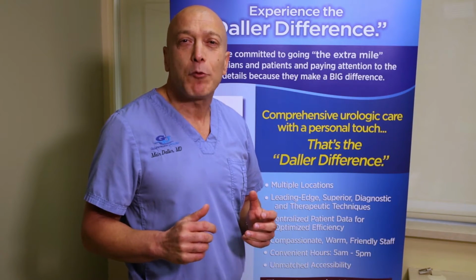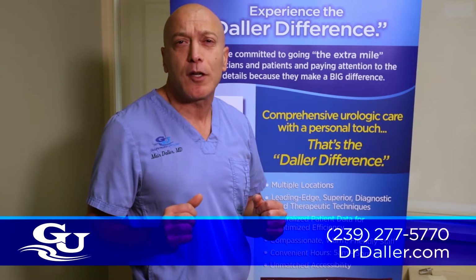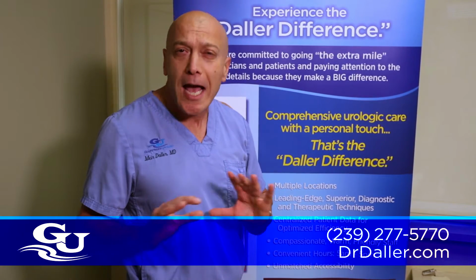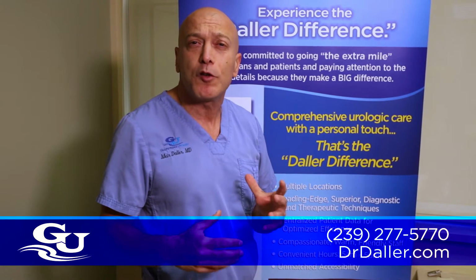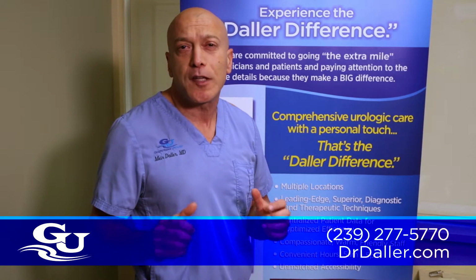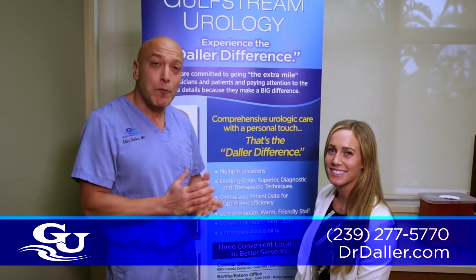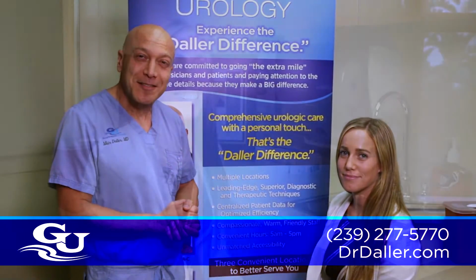Today I would like to share with you my method and experience in pain-free intramuscular injection of testosterone cypionate. This technique is useful for any intramuscular injection therapy. I had chosen the thigh muscle, also known as the quadricep muscle, as the most convenient site for self-administration. I have Kelsey here with me to help with this demonstration, starting with washing your hands and gathering your supplies.